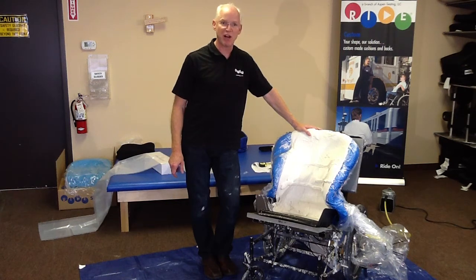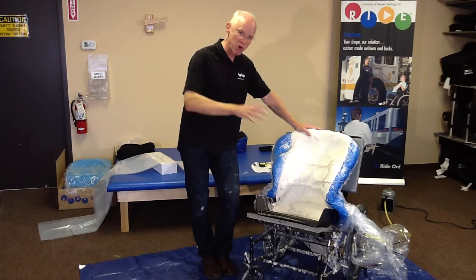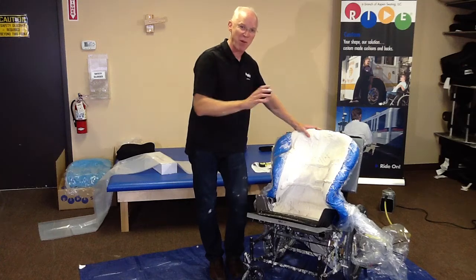Hello, this is part 3, I believe. We have captured Jenn's shape. We have done our seat depth, pictures, trim lines. We removed the blue foam from the simulator pan and cast it down into the pan. We let the plaster dry while we did our order form.